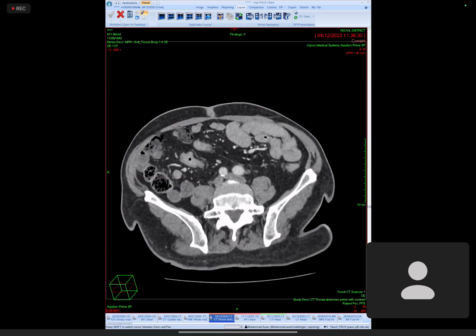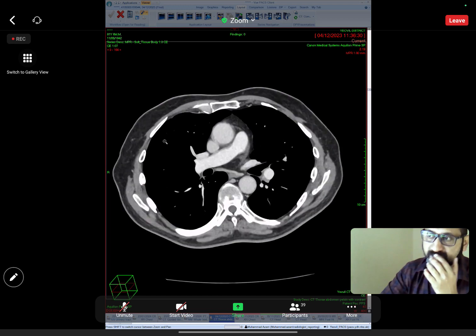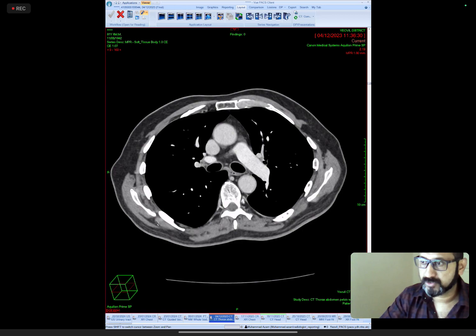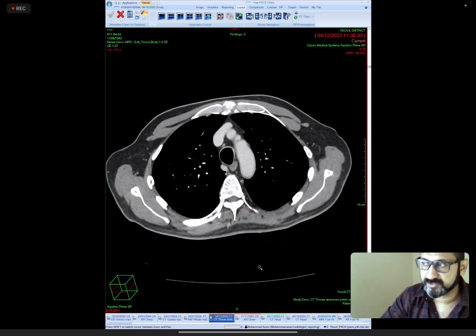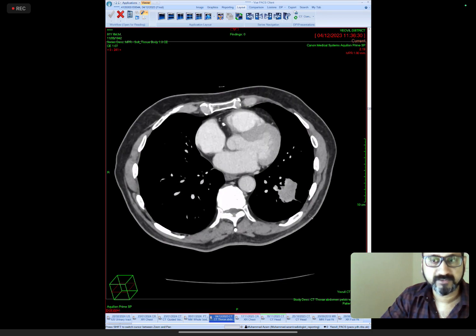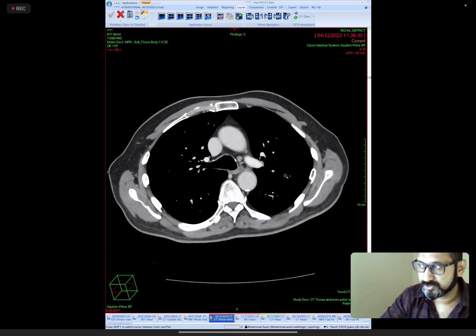The examiner would say that there is no metastasis. You would have said already about no lung nodules. At the same time, you ask about the bones, and the examiner would not take much time, and he would say no abdominal abnormality, no bone abnormality. Then you would say that you would send this patient for lung MDT discussion for potentially CT guided biopsy. That's it.